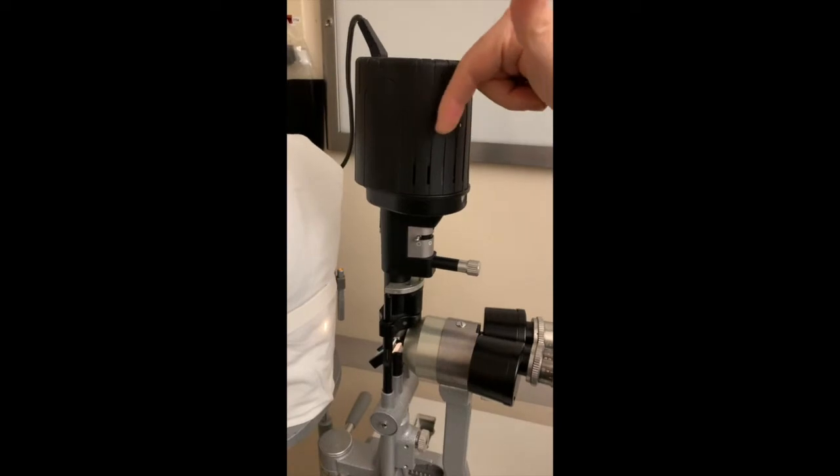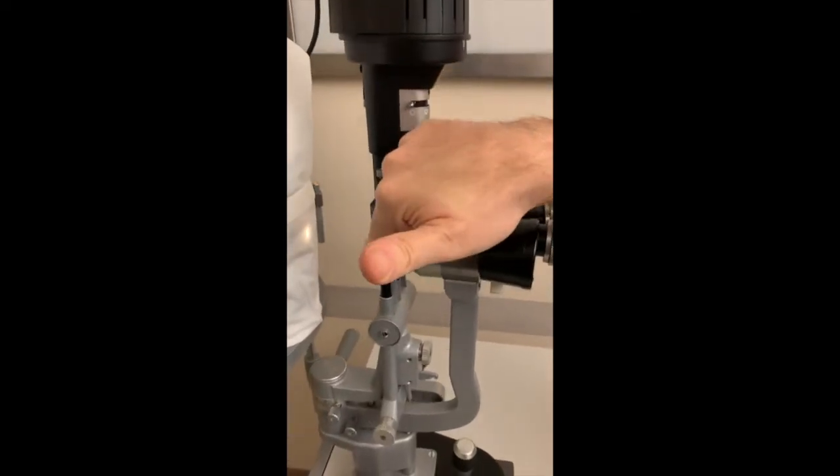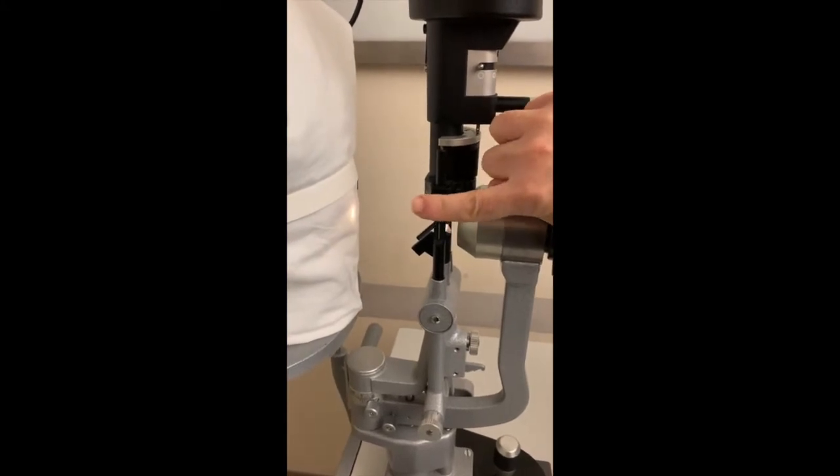The light is generated and travels down through here and then hits a mirror, which then projects the light that way.